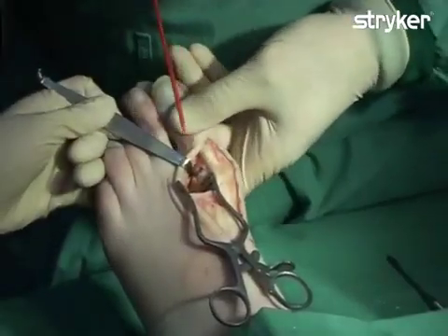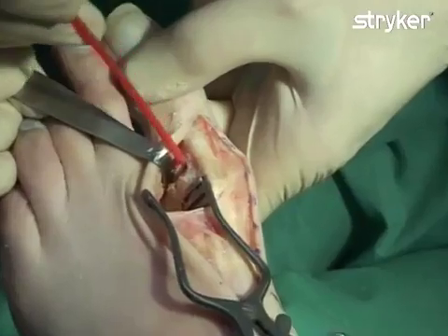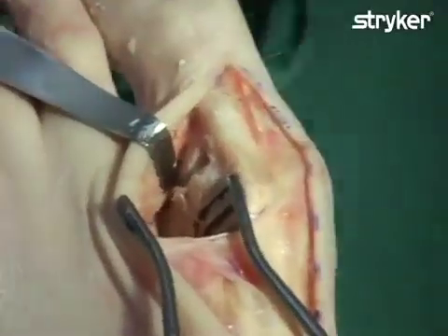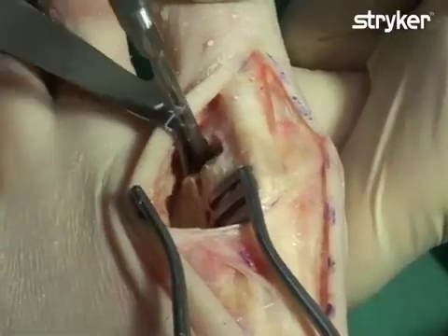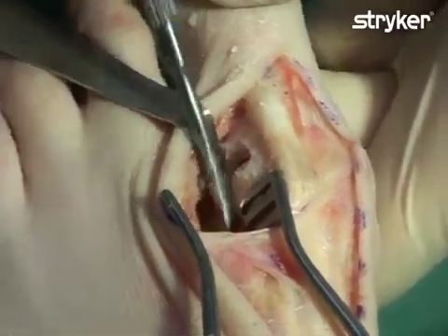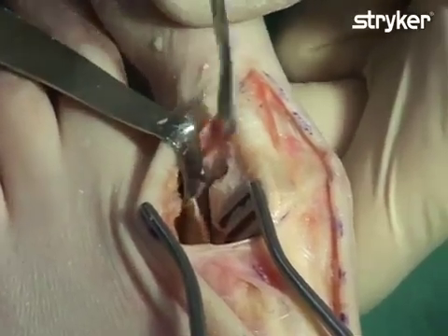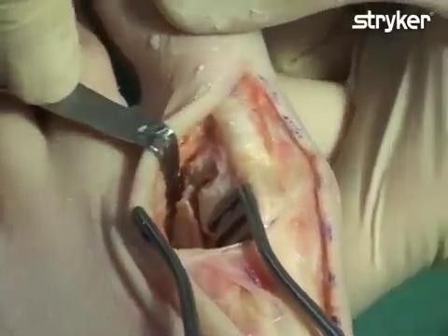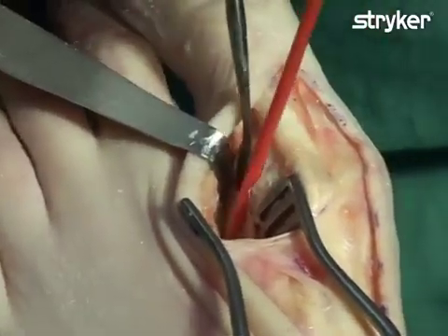The lateral capsule release is then performed. To perform the lateral release, we first incise the lateral capsule. An elevator is then placed underneath the metatarsal head, between the head of the metatarsal bone and the sesamoids. The adductor tendon and the fibular sesamoid ligament can now be easily visualized.